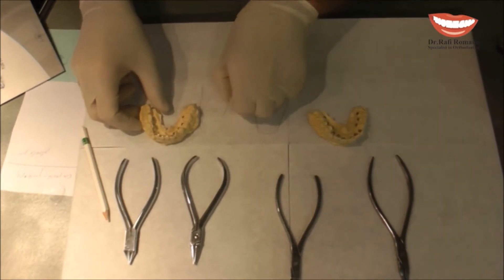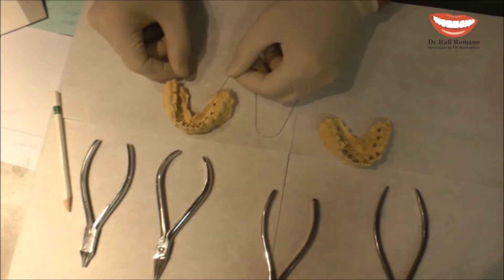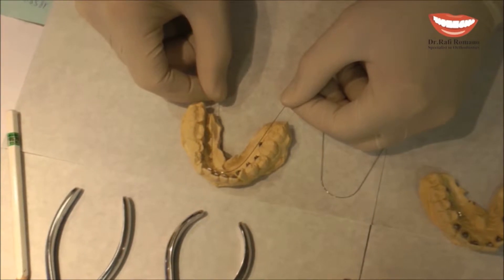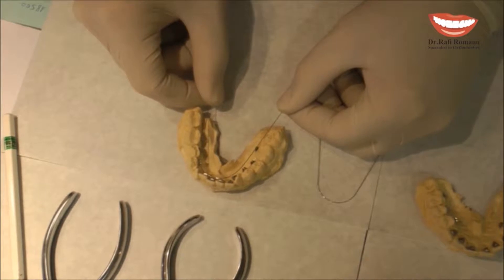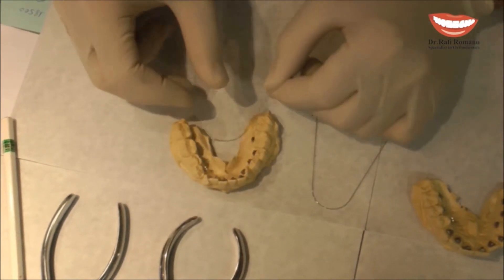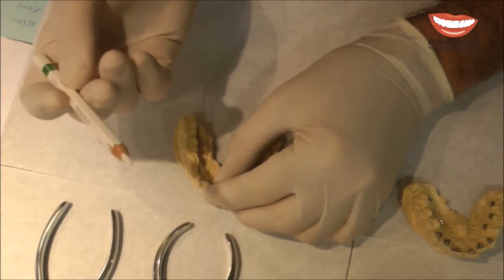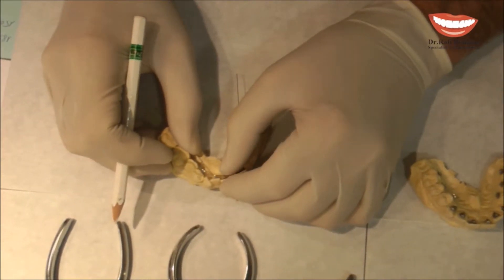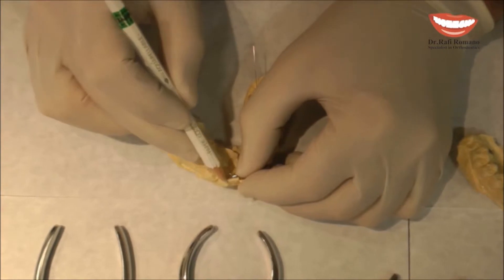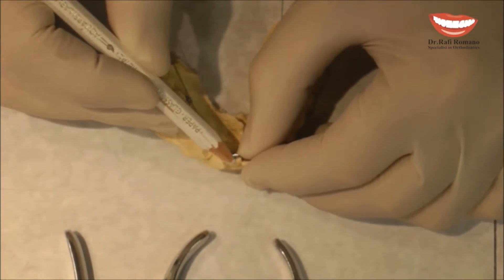First of all, we take the wire and put it on the model, trying to see if the shape of the arch looks almost the same as the shape of the wire. This is the first wire, so it has some flexibility — usually it's a nickel titanium wire and we won't get all the transverse effect from this wire. I place the wire in the anterior slot, then take a pencil designed to mark signs on the wire and mark exactly where I want the band. In this case I didn't bond a bracket on the cuspid because it has overlap, so I place my mark somewhere between the lateral and the premolar.